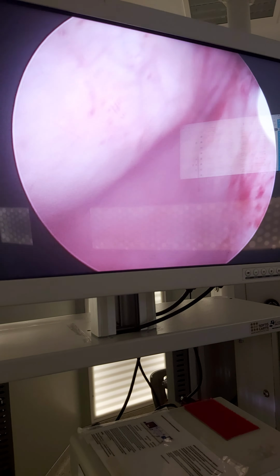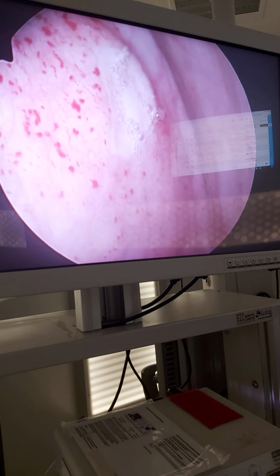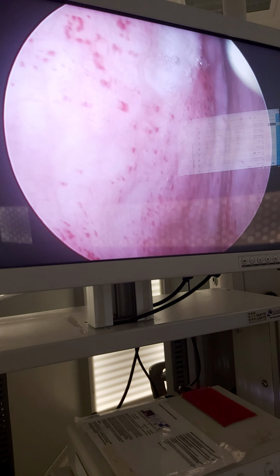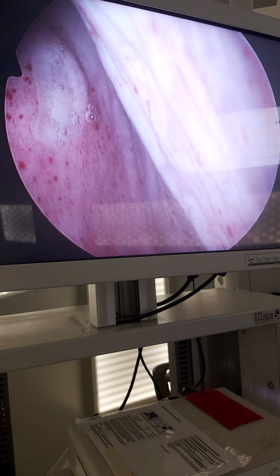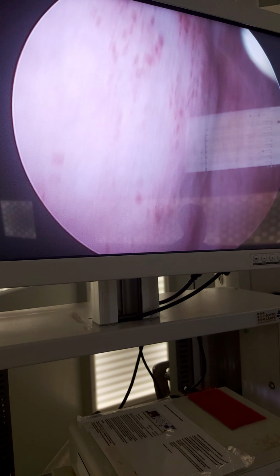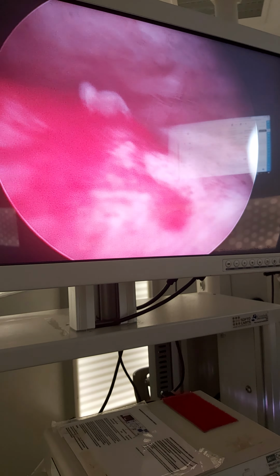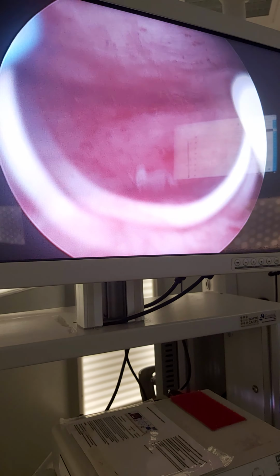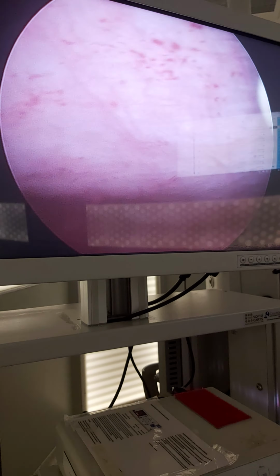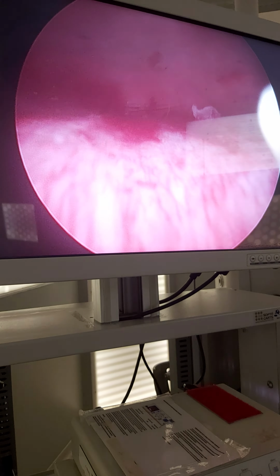Now we see the really inflamed cells. Here I will make a fulguration. I mark this part, but when I now look, this is not in contact with trigon. This is in contact with this part. Maybe they are touching to each other and making inflammation. Anyways, my first suspicious place is trigon. I will treat that part first, then rest of the bladder.